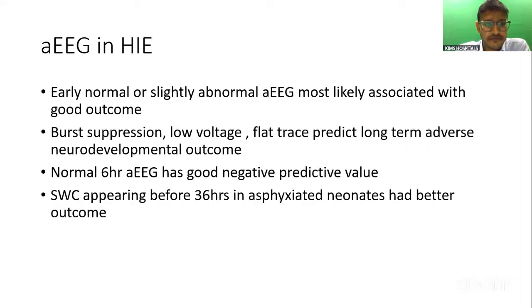Also, for the initial 6 hours, if the amplitude EEG is absolutely normal, then it has a good negative predictive value for poor neurodevelopmental outcome. And also, if the sleep-wake cycle, which appears before 36 hours in asphyxiated neonates, is seen, it is associated with better neurodevelopmental outcome.